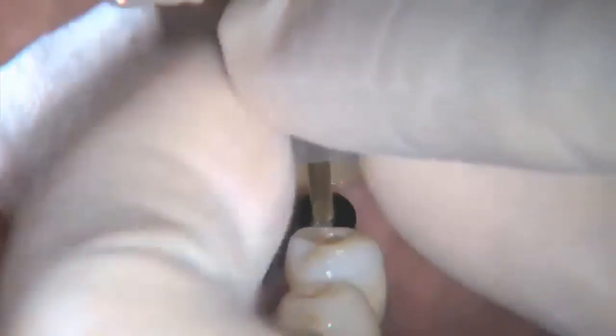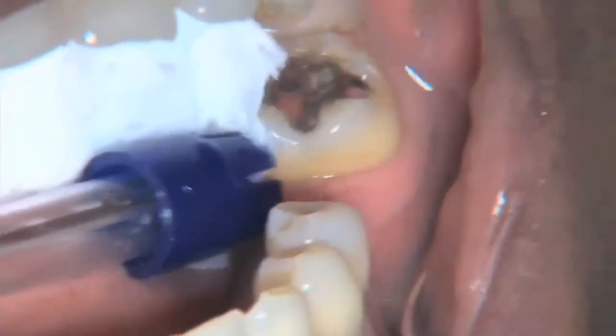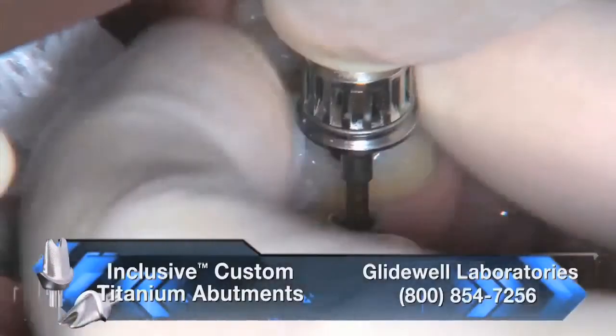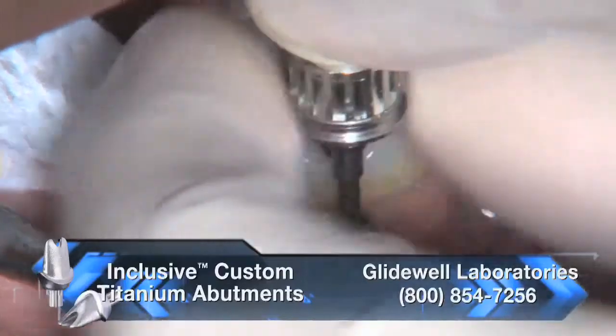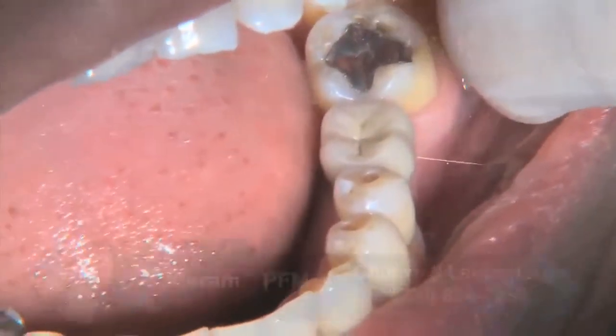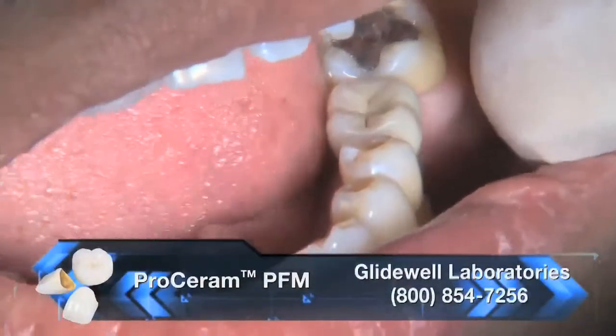So at 12 weeks we are now ready to deliver the abutment and crown. After removing the healing abutment and irrigating the screw access hole, the abutment is fitted to place and the screw is then tightened. Adjusting the occlusion is a very important point to be considered.